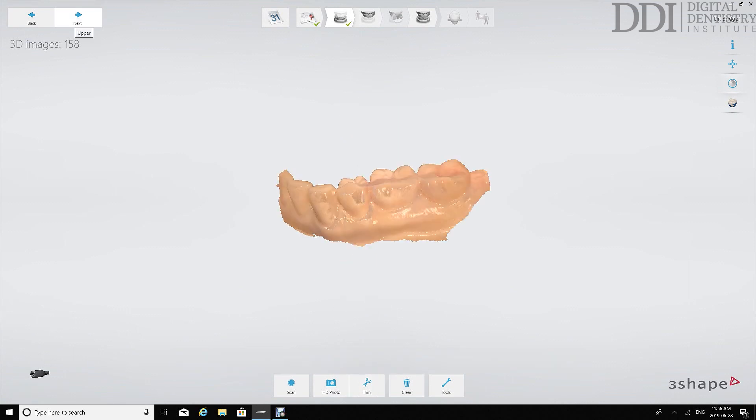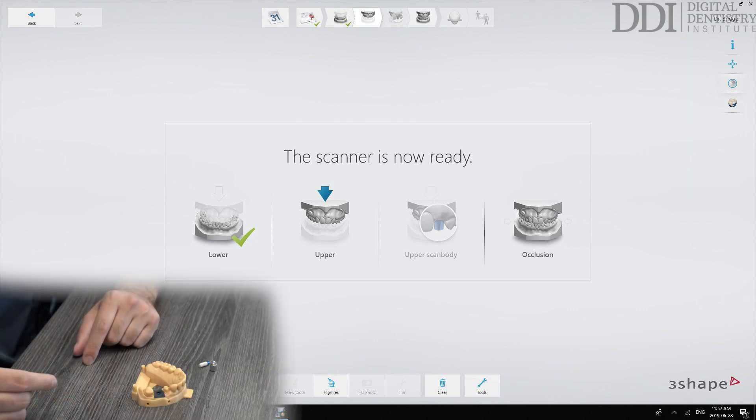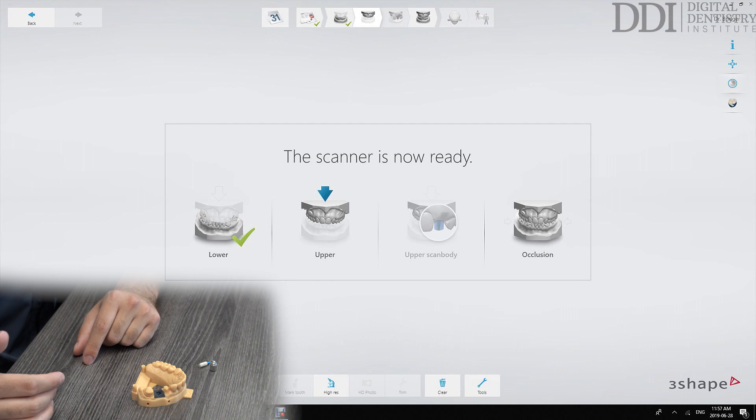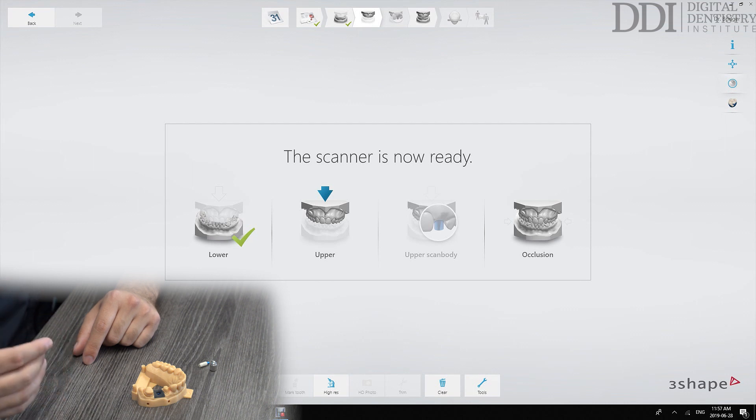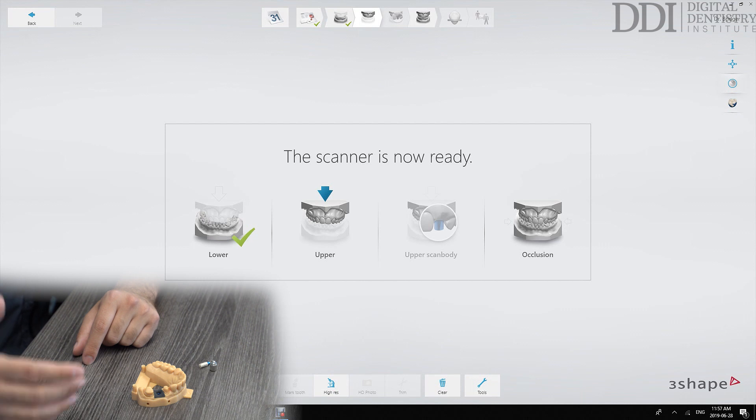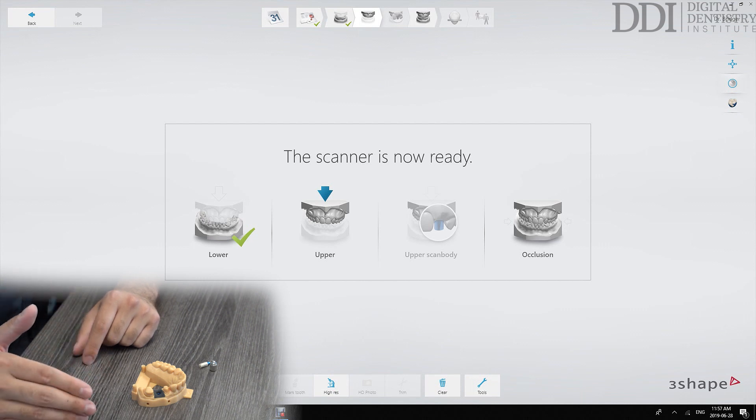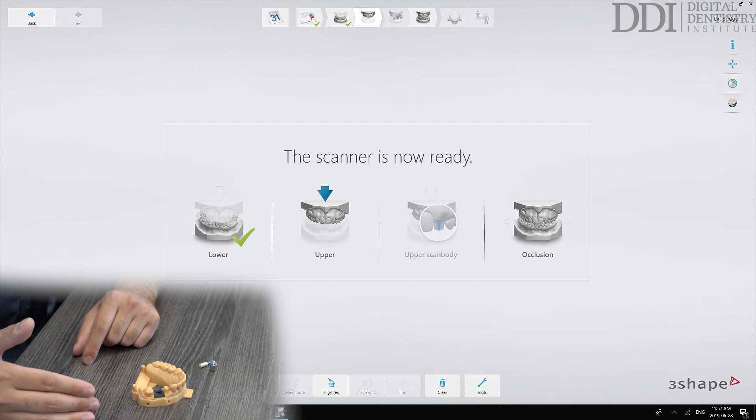So at this stage we can go to the next screen which will take us to the upper impression. What you'll notice now is that the screen shows two upper scans. The first is an upper scan and the second one says upper scan body. The reason there are two upper scans is because on the indication page we've identified that we would like to take an emergence scan.